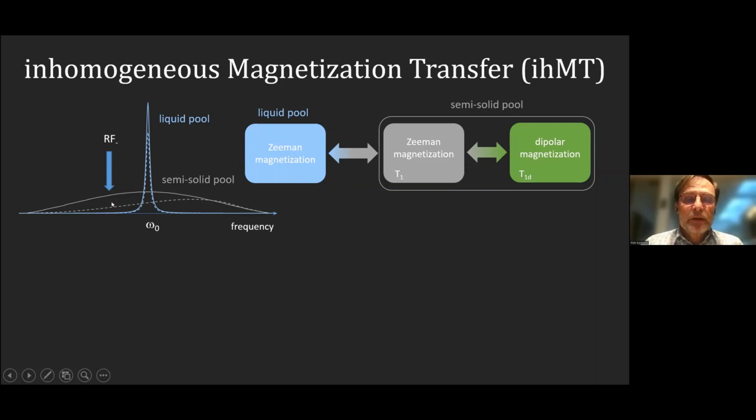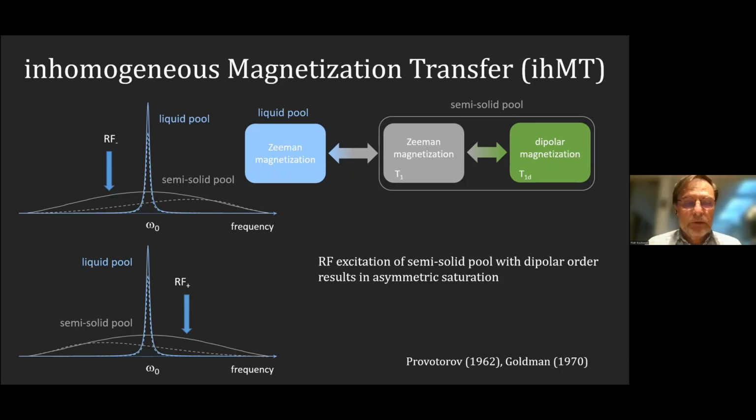So in addition to that, we can see that the saturation is actually asymmetrical.